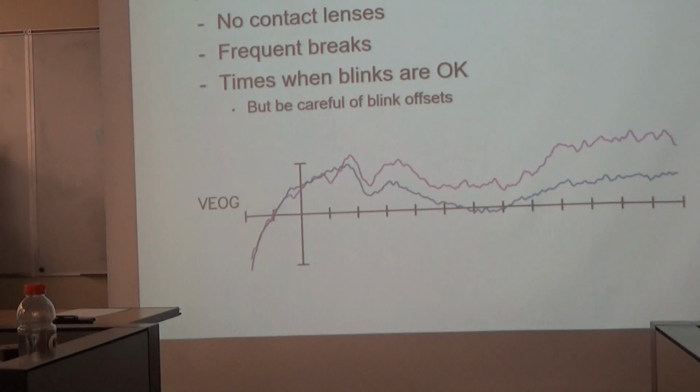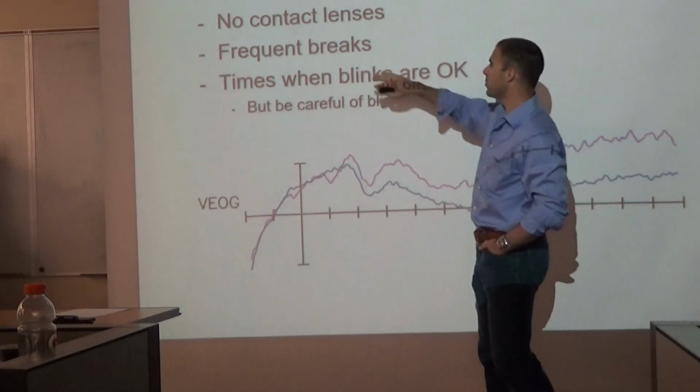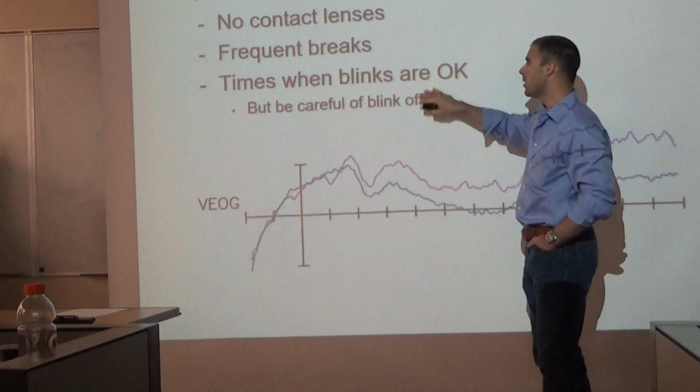We can also do the things that we talked about to try to minimize the blink. You want to take some breaks. You want to instruct them: when is it okay to blink, and when do you not want to blink? Things like that.